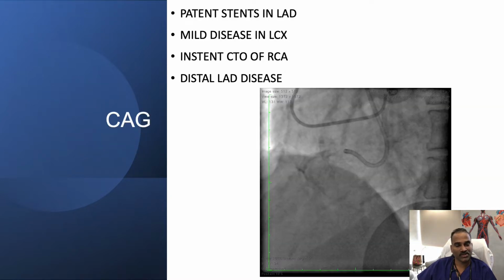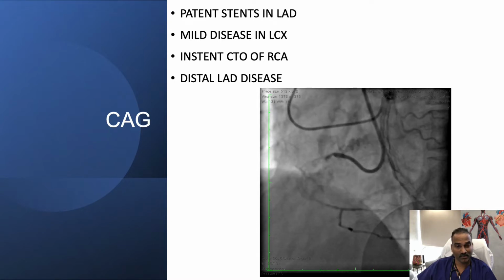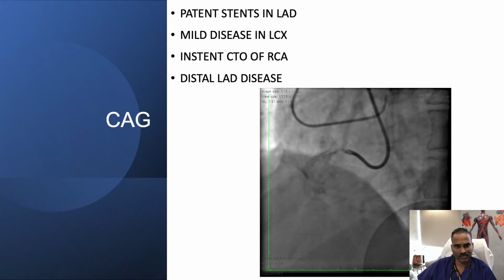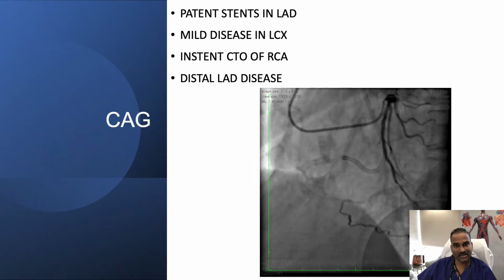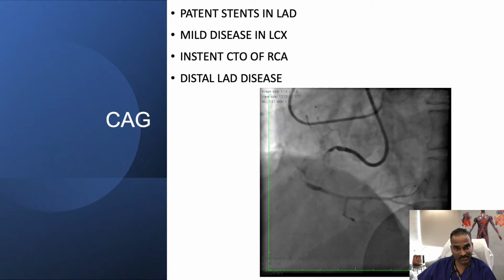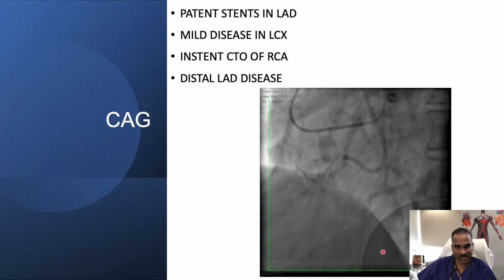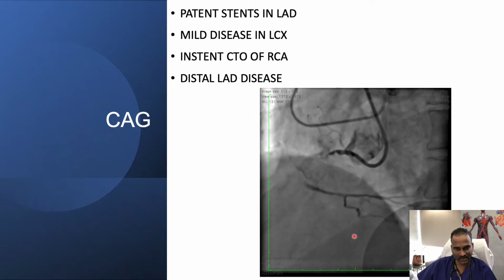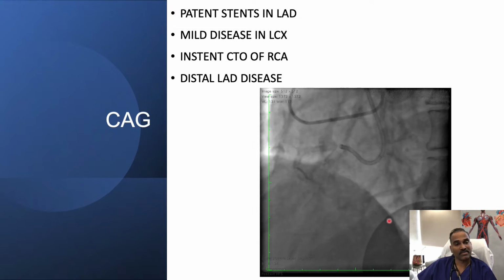So as I don't have the angiogram, I'm showing dual angiography directly. You can see here the RCA is a total occlusion, in-stent, proximal to mid, and the left system is filling nicely. There is a patent stent in mid and proximal LAD, and there is a good epicardial collateral coming from LAD, filling the PDA almost instantaneously. So it's a major epicardial collateral.